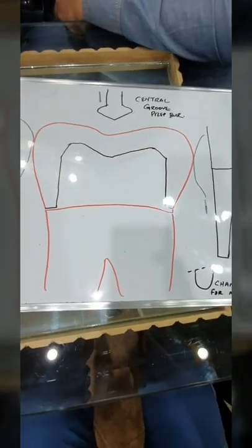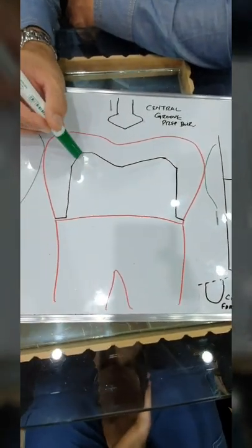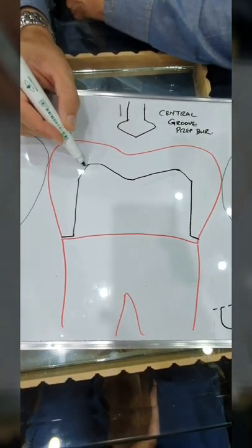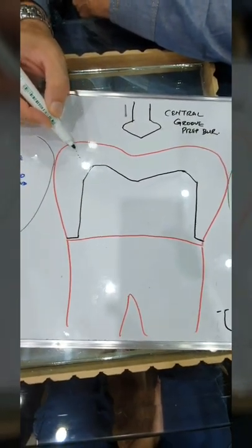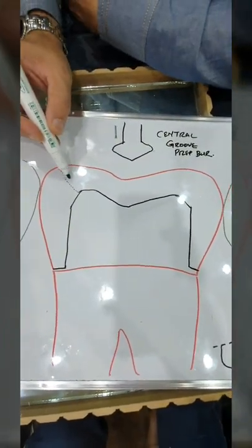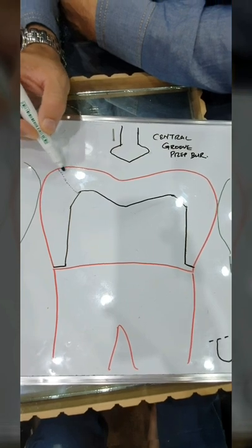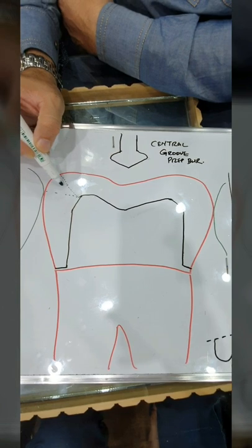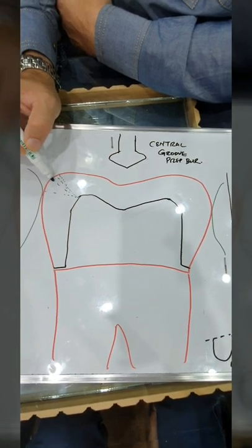As you go further down onto the tooth, if I were to place a margin here, because of the enamel rods, this is the orientation of the enamel rods, so the margin should be like that. If you make the margin less, then you have unsupported enamel. If you make the margin at this point like that, all of these rods would be unsupported.